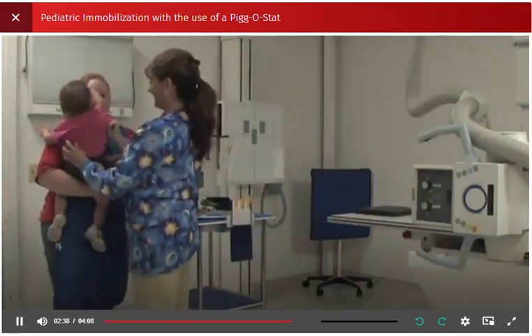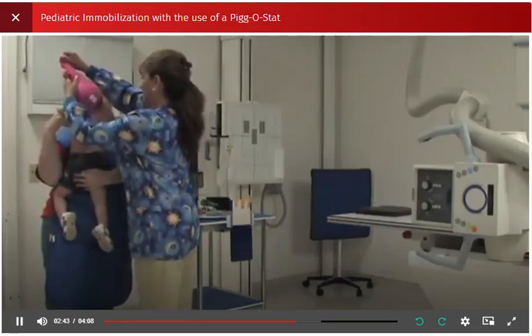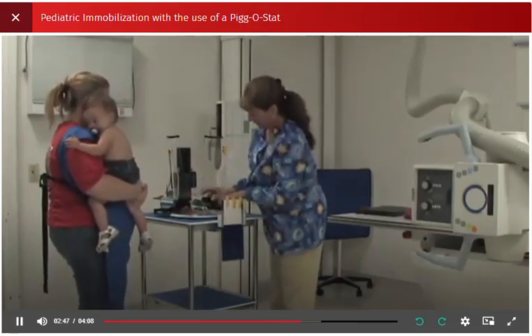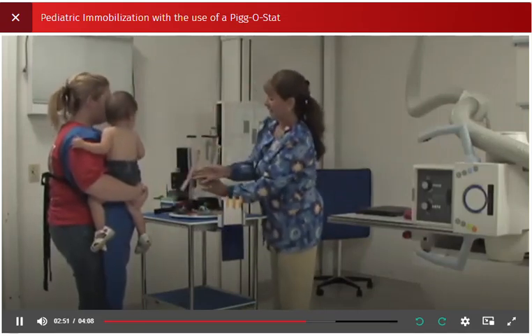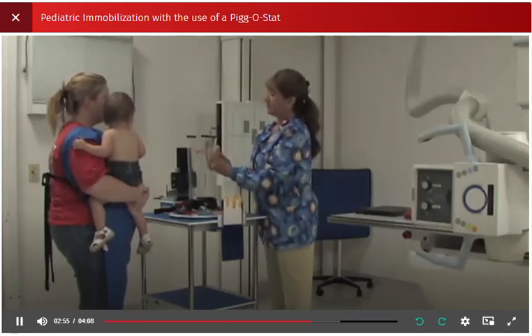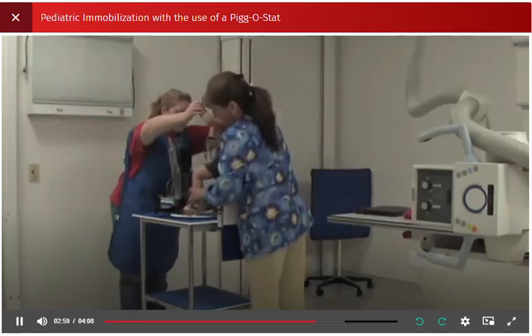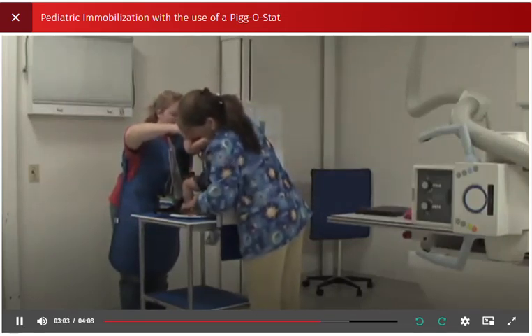Next, assist the parent in removing the child's clothing to avoid any artifacts on the images. Give the parent instructions as to how the child will be seated in the immobilizer. Both the technologist and parent will seat the child in the immobilizer so that the patient is in the posterior-anterior position. The technologist will guide the child's feet as the parent holds the child's arms above his or her head.